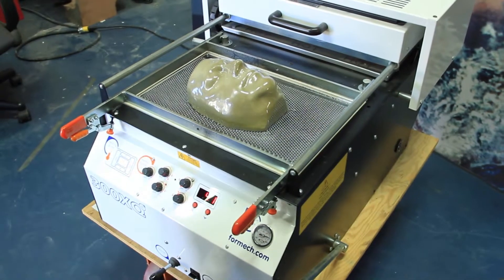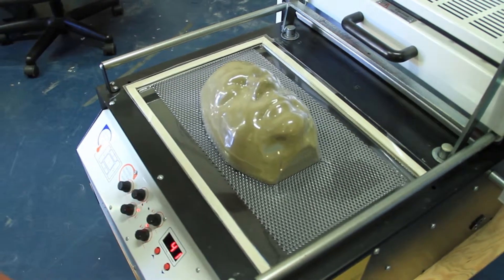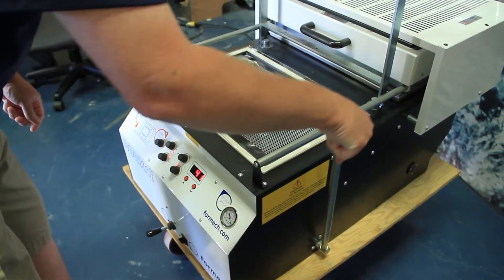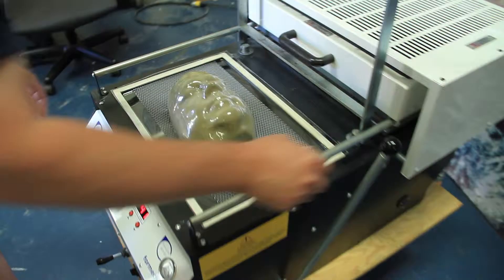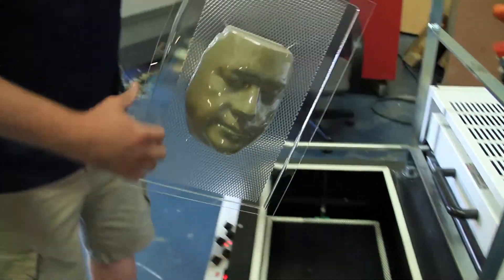Now that the impression has been made, the plastic can be left to cool in its new shape. Finally, turn off the machine and carefully remove the mask and mold together, keeping in mind that they may still be very hot. Once both have been removed, the mask is then ready to be cut away from the mold.